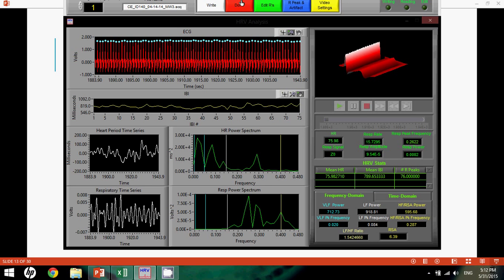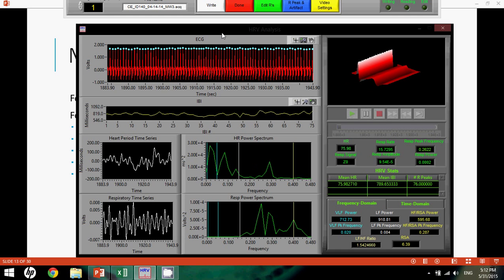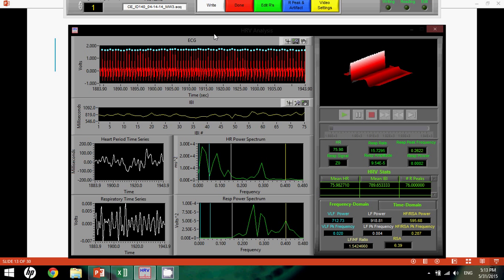You'll see that mine's chopped off a little bit. This typically is not the case, but my screen settings are just a bit off. You can move these both around typically, and there's a lot of information to look at. You basically see your file up here. This is your segment up here.